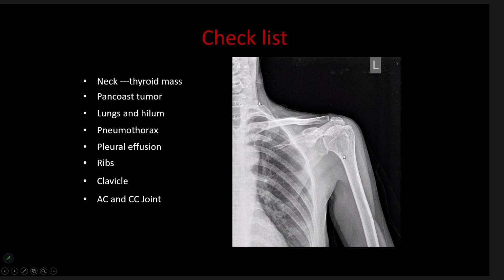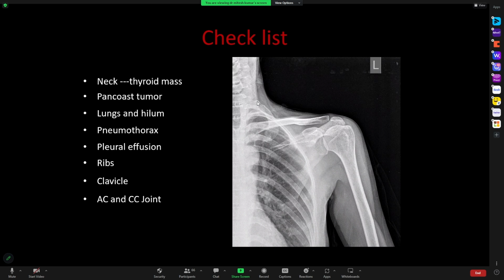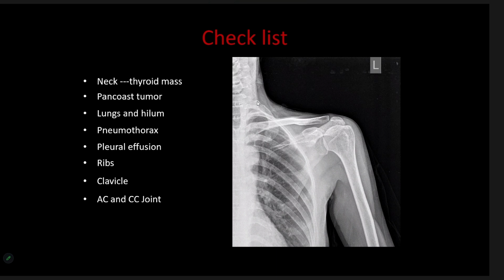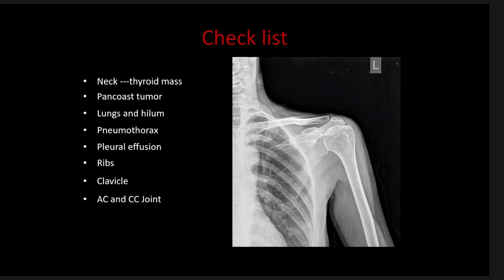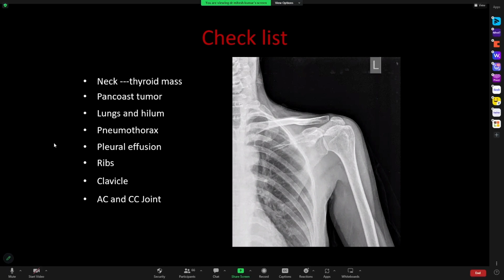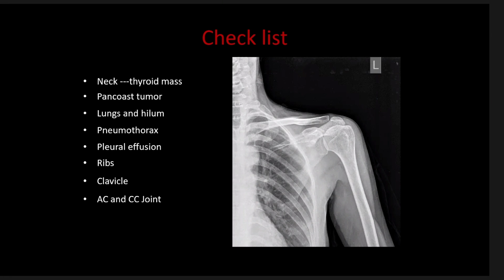But maybe for 2B rapid reporting. In Viva, though, if someone is showing a supracondylar fracture and the candidate does not tell about the anterior and posterior fat pad, the anterior humeral line and the radiocapitellar line, then that reflects badly. It does. So in that way, there can be one or two extra findings. I totally agree. And there's one more question from Shweta Gupta.